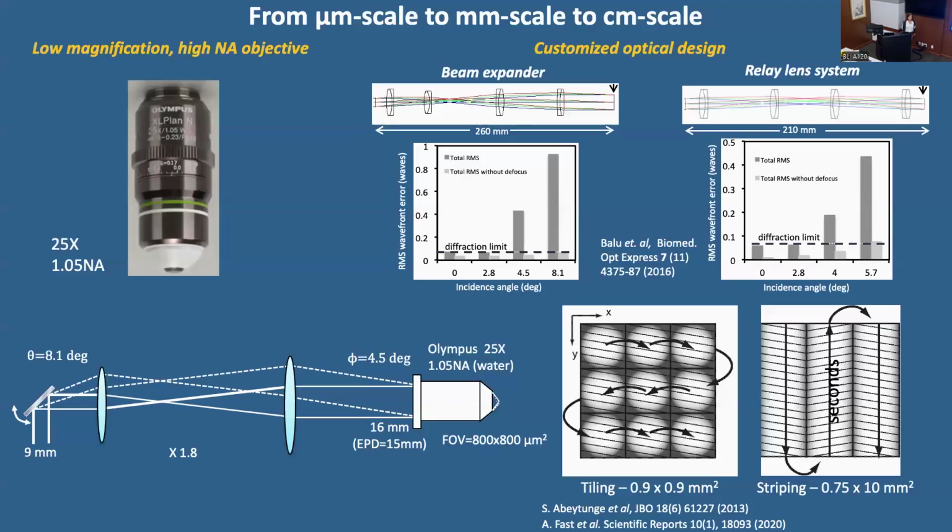Even when we use a beam expander, are we still limited by the F number of the objective, or can we go beyond? We overfill the back aperture of the objective, so we use that. So we're still limited by the objective aperture. Yes.